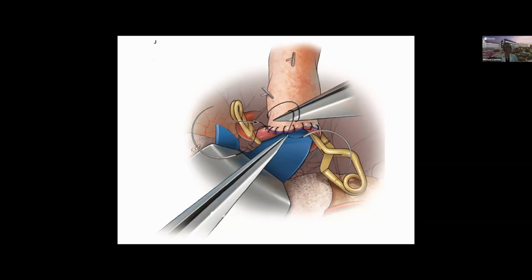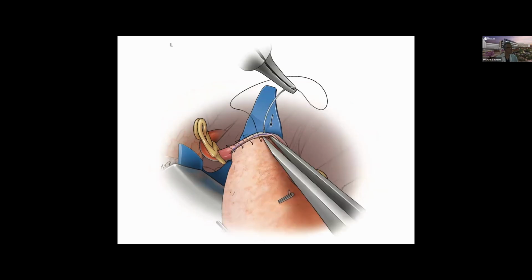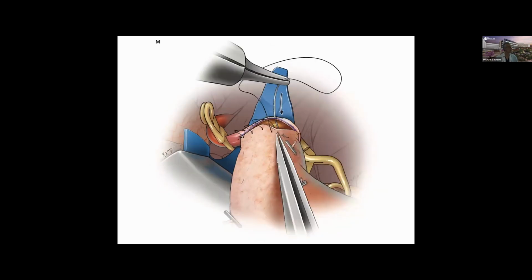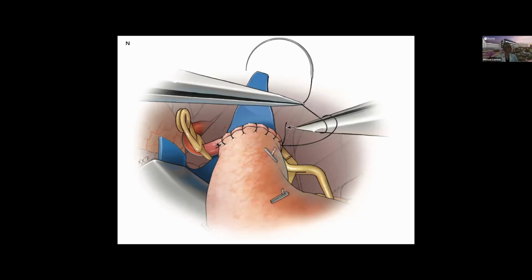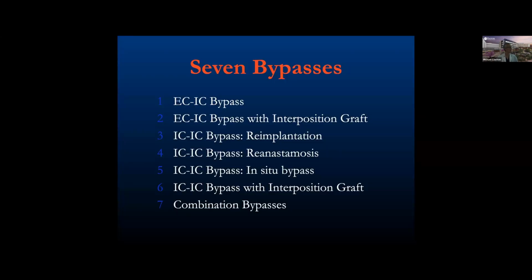Then you tie things down. You flip the artery to the other direction. You can inspect the suture line, make sure all the stitches look good and there aren't any through stitches. And then you continue with your running suture on the opposite side. So here we've finished, we've tightened, we're tying it down. And then as the clips come out, you always want to see a little bit of bleeding there. That's a sign that there's good flow, and you just need to be patient for a minute or two, and the platelets will set up and get that bleeding under control, and then you're done.